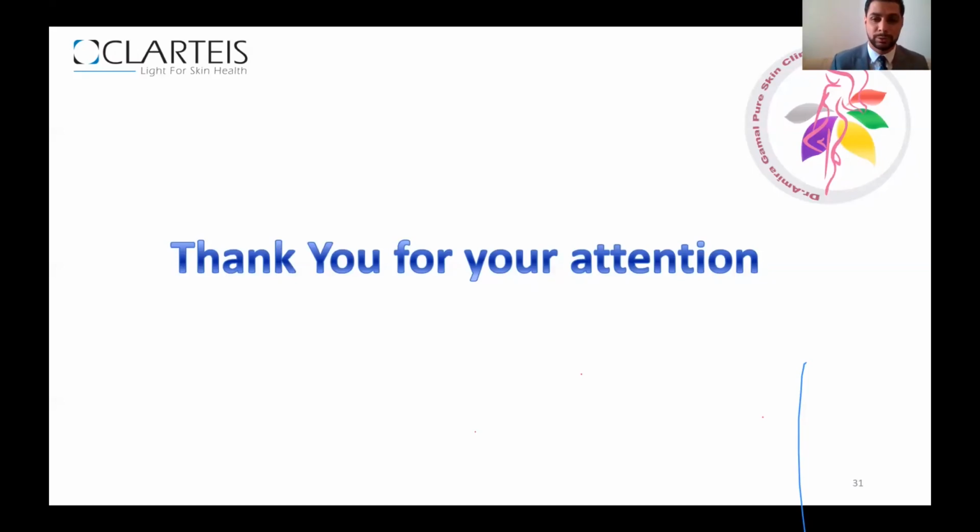Okay, just to explain a little bit why we will use Excimer plus fractional laser. I mean, what is the role of fractional laser or the microneedling? Maybe some doctors are asking these questions and would like to hear from you. Yes, it's very simple. It opens channels which lead the laser and the medicine to go in and be absorbed faster and give us faster results. It opens channels that the laser will go inside.